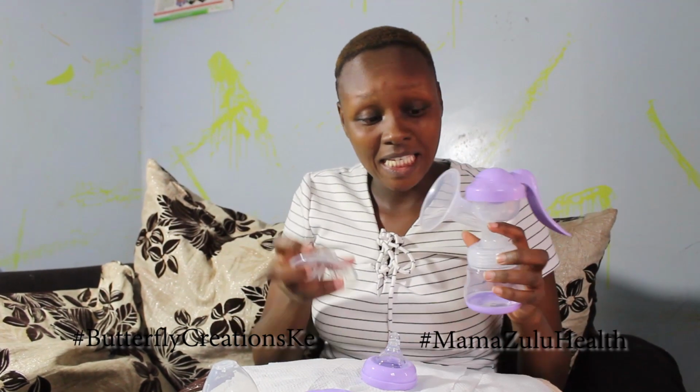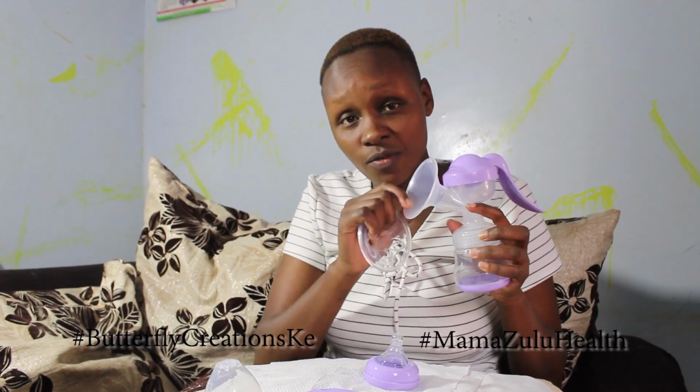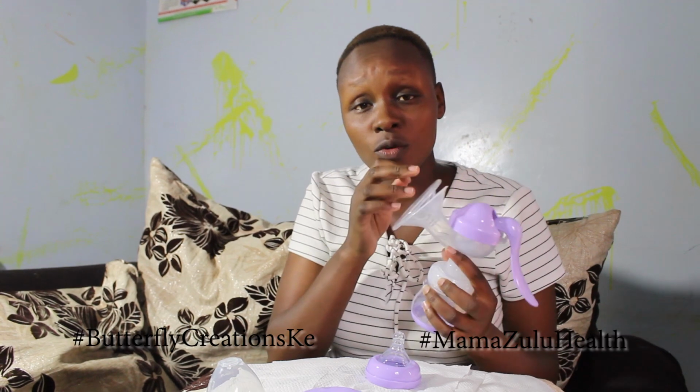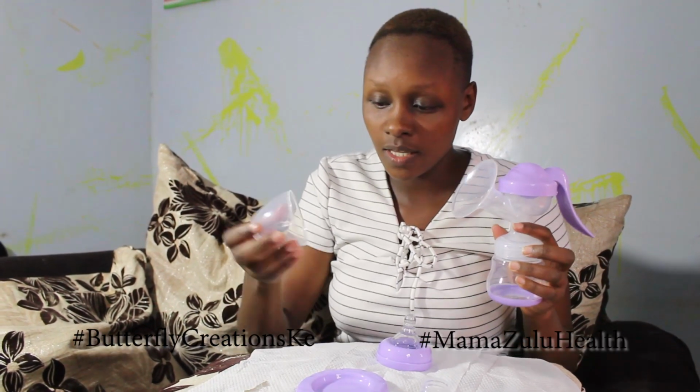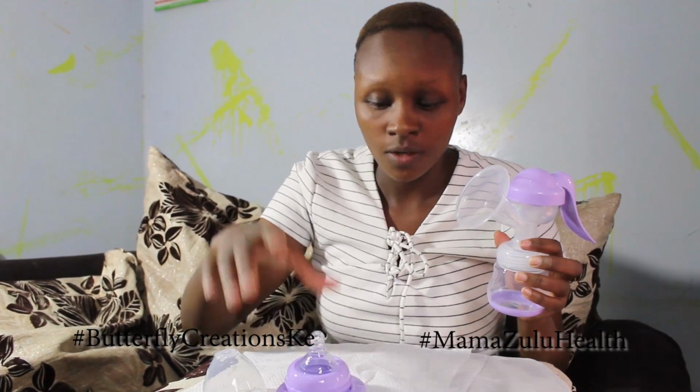So usually this is here, it's just to help. This is plastic, like very firm, and this is soft. So if you don't like very hard things, you can put this here just to make sure you feel comfortable and soft when you're doing the same thing. But myself, I don't like doing this. I feel like this works faster than when you do the soft things. And this one, I'll show you how to do this and this after we finish.